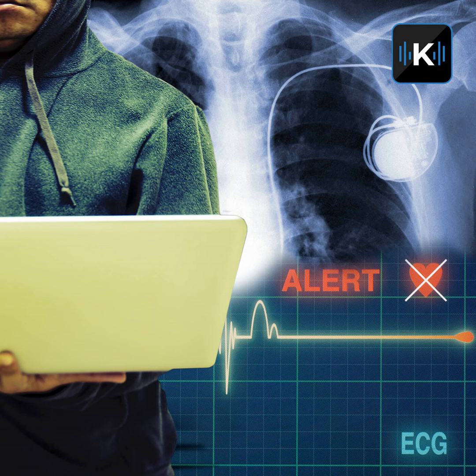So should we ask our doctors certain questions? I mean, it would make sense to start with, is the software on my pacemaker up to date? Or what measures are you taking to protect my insulin pump? I mean, the doctor should know about this, right? You can certainly ask those things of your doctor, but I doubt your doctor would have an answer. If you're really concerned about it and your doctor says you're getting a particular manufacturer's device, I would go look up and do my own research on that manufacturer's device and any security bulletins that have been released by the manufacturer.